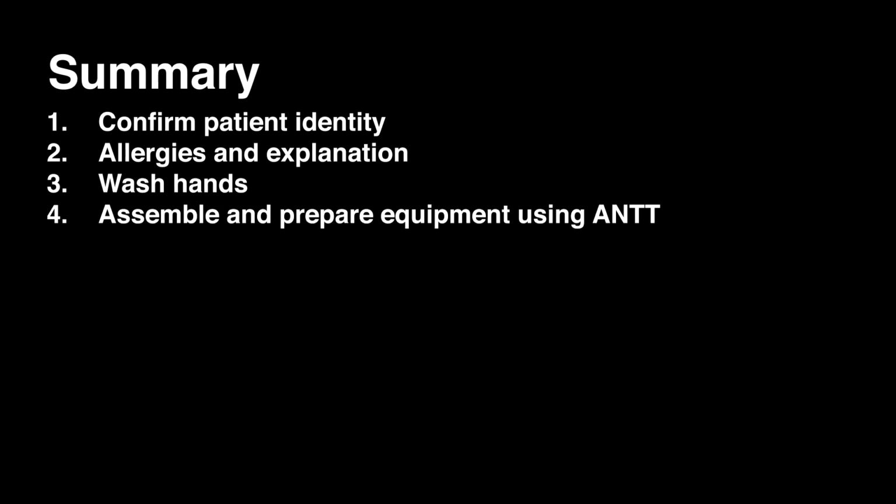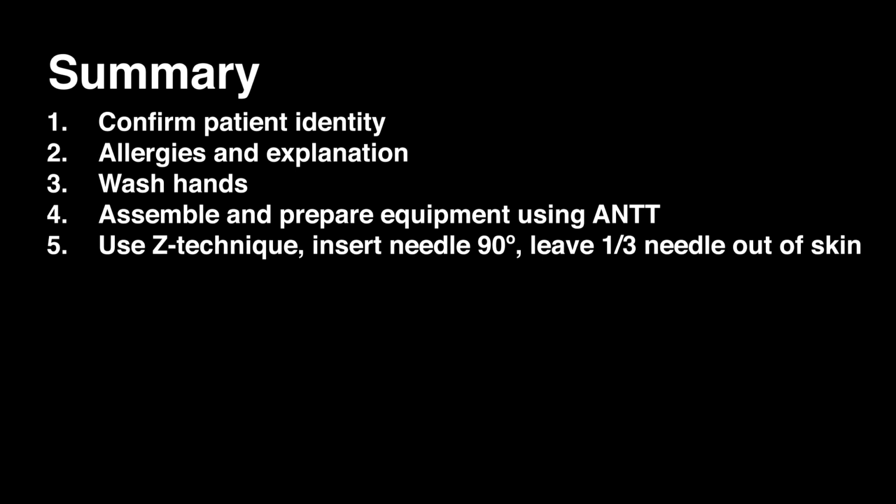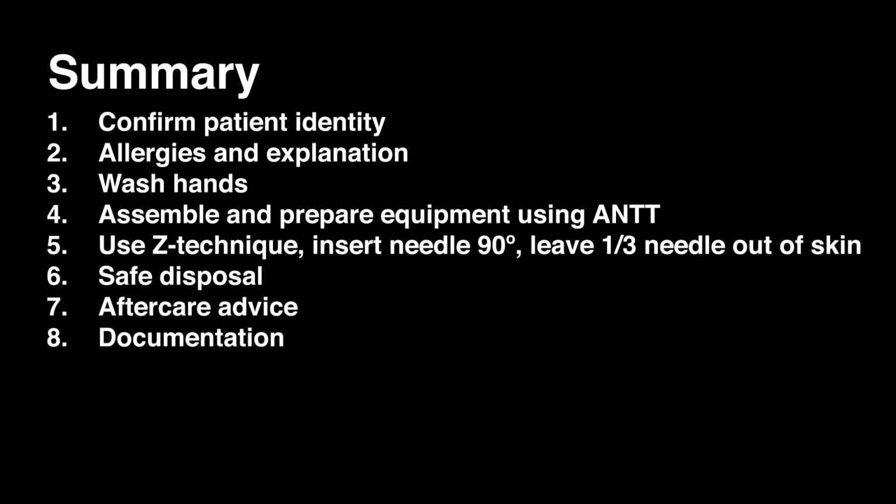In summary, for this procedure, you need to confirm your patient's identity, ensure the patient has no known allergies and the procedure is fully explained. Wash your hands, assemble and prepare all equipment and drugs ensuring the aseptic non-touch technique. Use the Z technique, inserting the needle at 90 degrees and leaving 1/3 of the needle out of the skin, remembering to clean the skin first if it's not socially clean. Ensure that all sharps are disposed of safely, ensure that adequate aftercare advice is given and that the correct documentation is filled out.